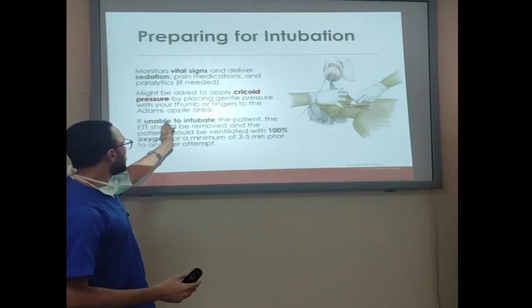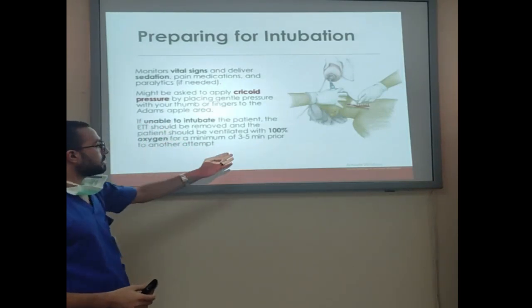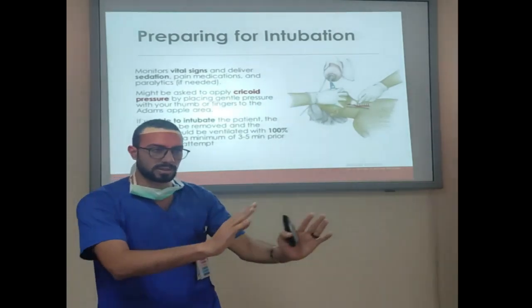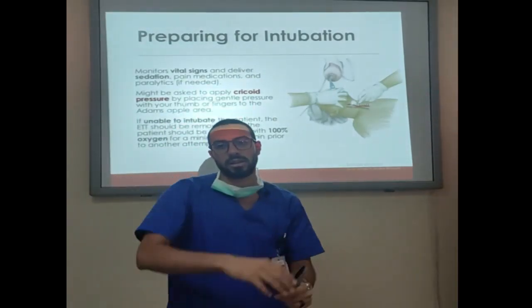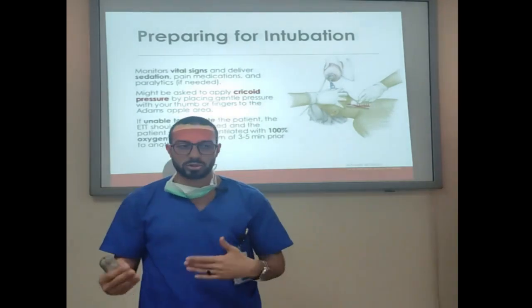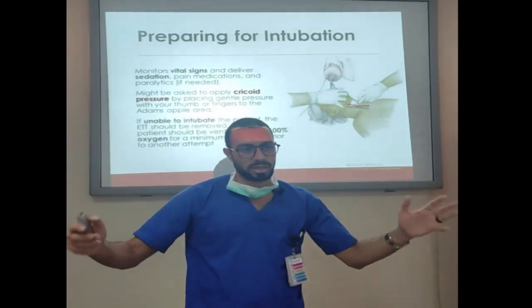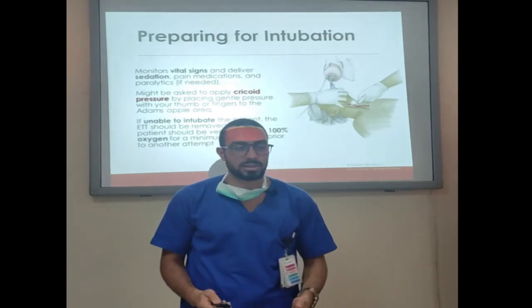Anyway, at the end, if unable to intubate, this is very important: if you have desaturation, you should stop the doctor. Please, we have desaturation, and bring the BMV and give 100% oxygen just to support the ventilation and the oxygenation. So this is our role during the insertion of the tube.